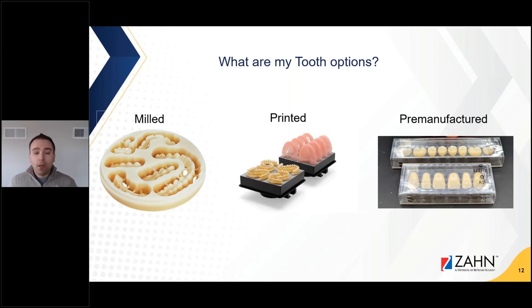When it comes to printed teeth, we're going to mention some things later in the presentation about what's currently available and what's coming to the market. But generally speaking, there was a first generation of 3D printed resins that came out onto the market, Formlabs and others, and they were okay, but they were lacking aesthetics quite a bit. That was the main downside to 3D printed teeth. However, in the last year or two, which I will mention later, there's been some new development that's really exciting.